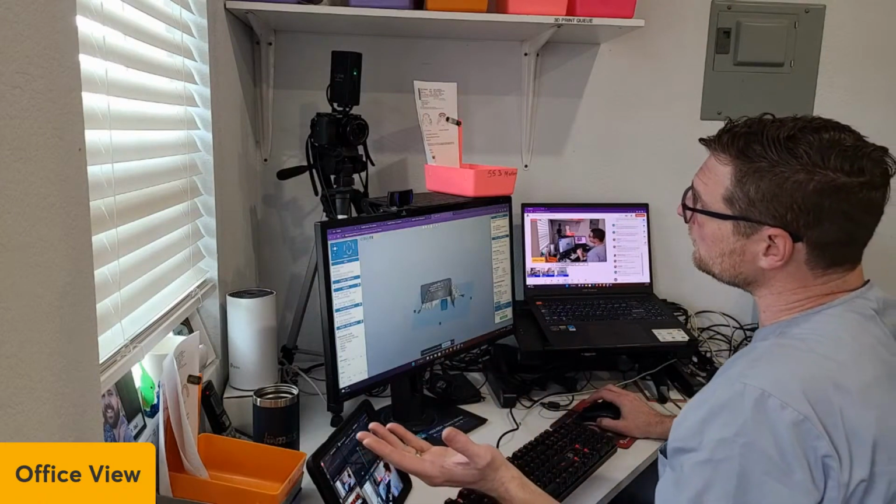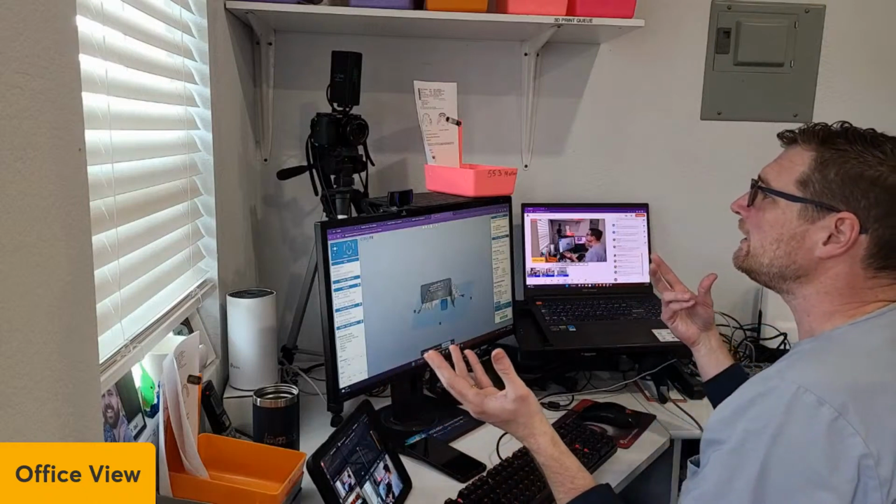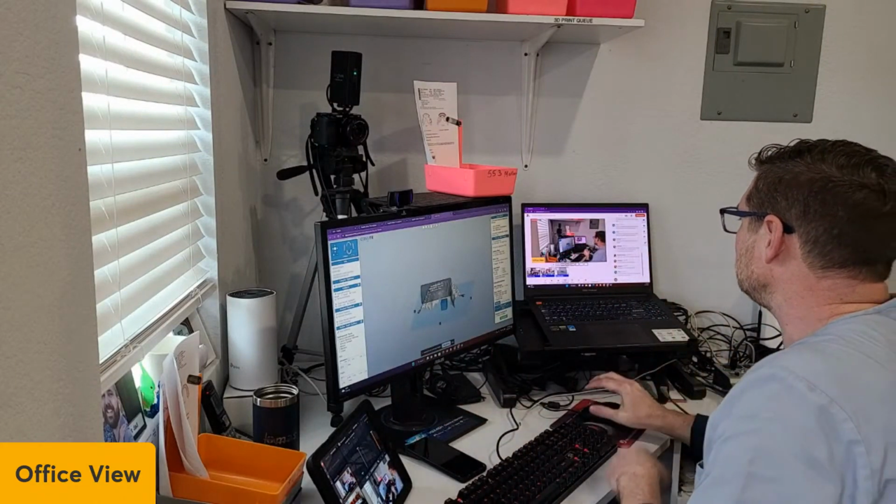So it's actually a pretty good deterrent for phone calls. They're like, where's this case? They can actually look on there. It's like, oh, it's been shipped. We don't have to call, and we can track it. Oh, it's going to be here Tuesday, so we can get the patient in on Wednesday. So that's the beauty of EasyRx, and it being able to house scans in with the patient file, and it sticks with that patient file forever.